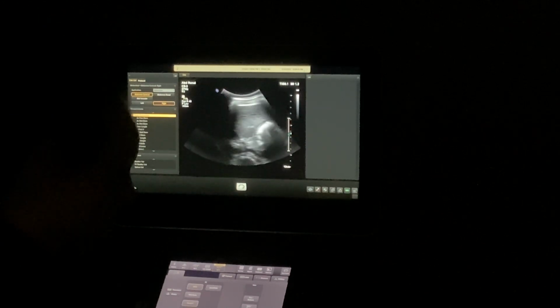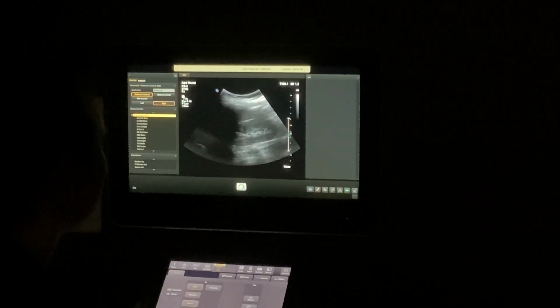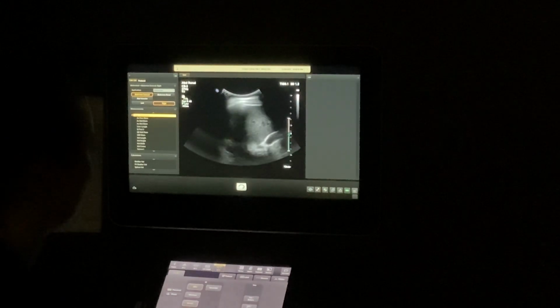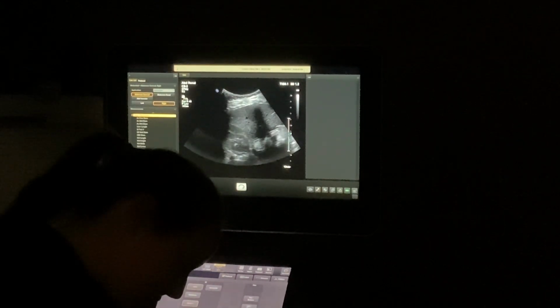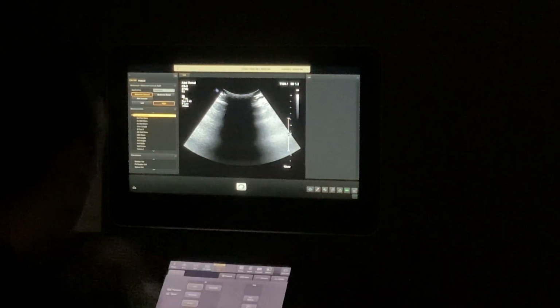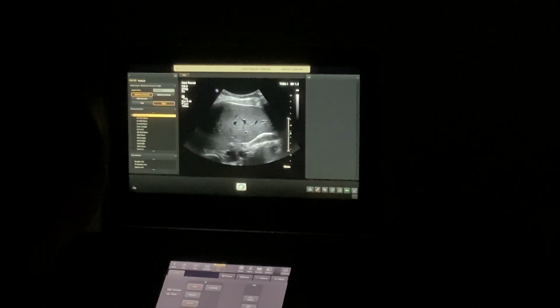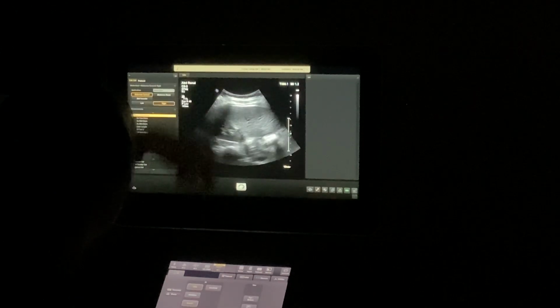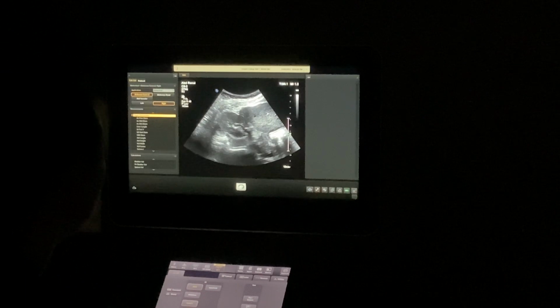Okay. So now, perfect example, I've got contact loss here. When I turn trans, that put a curved surface on a convex rib, and so I've got contact loss. So I know exactly where I need to be to see her kidney. I'm gonna put gel here and gel here and go right back to where I need to be. Deep breath. And I'm not moving around too terribly much, and look, I've got contact now. So finding her kidney, there she is.